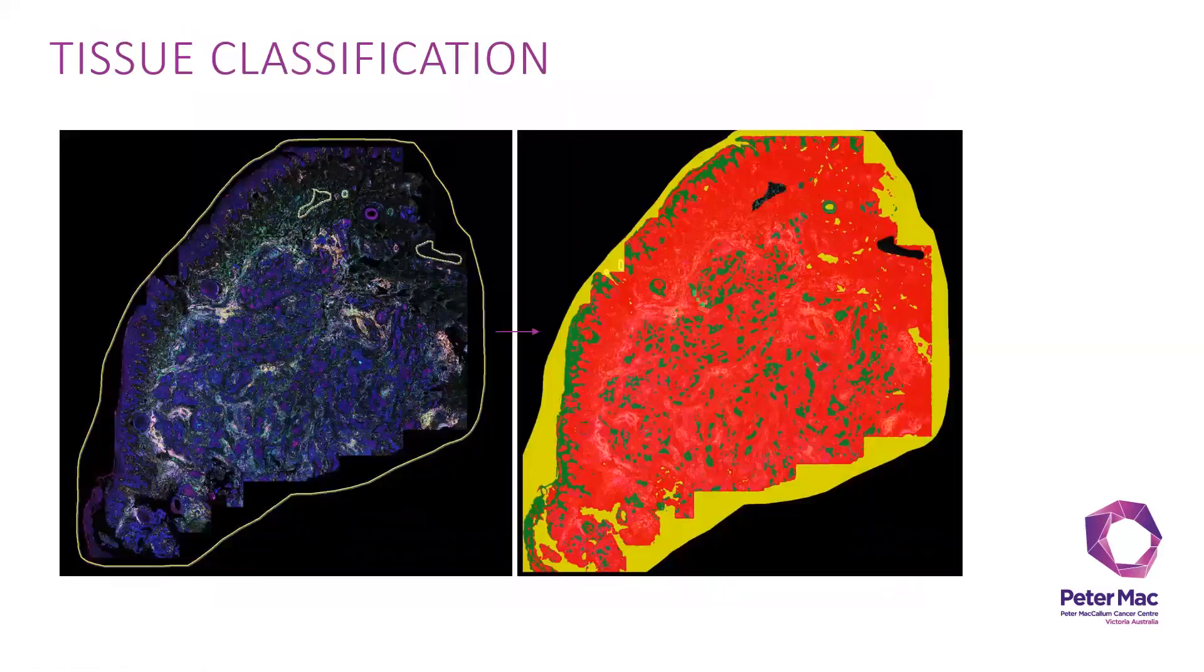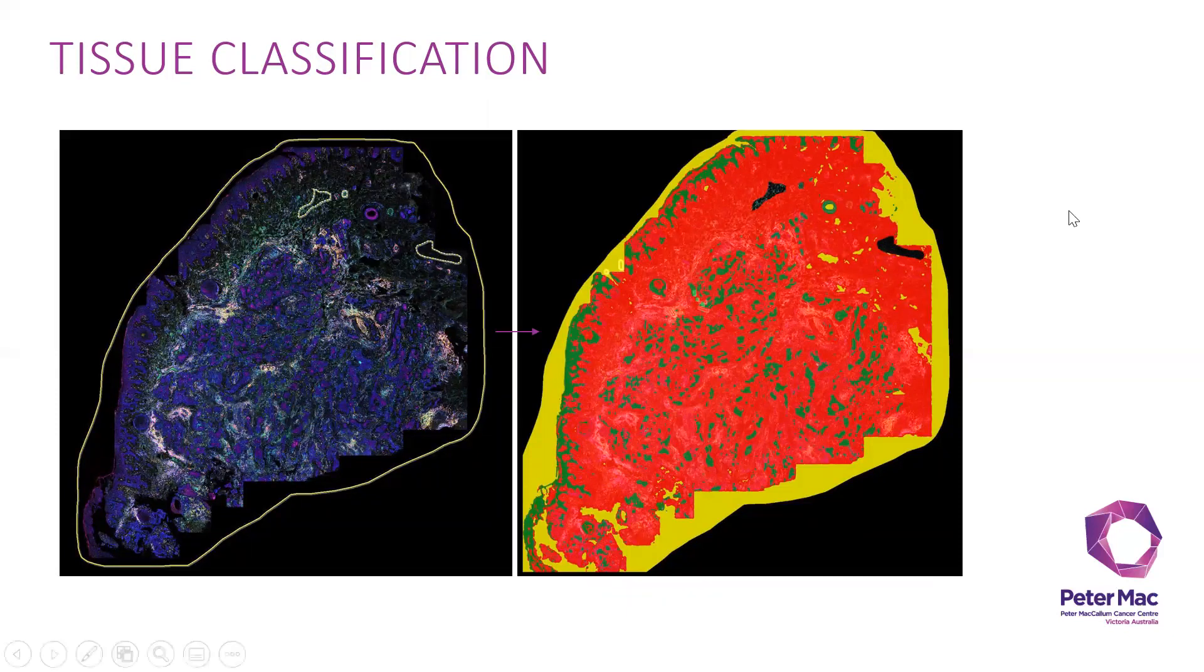In here, the left one is the manual annotation drawn around the tissue. Then I further classify it to three different classes here: tumor, stroma, and background.